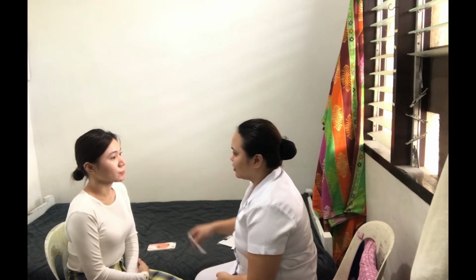Performing the Hirschberg test. From about 2 feet directly in front of the patient, shine a light onto the patient's eyes and ask the patient to look at it. Inspect the reflection in the corneas. So, ma'am, I'm going to light your eyes again and just look straight.